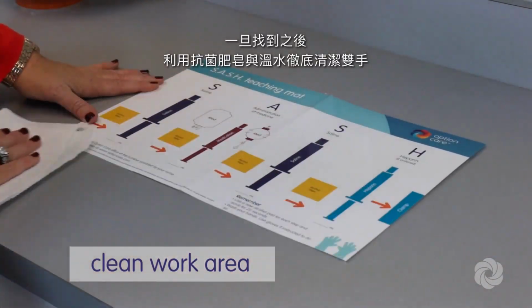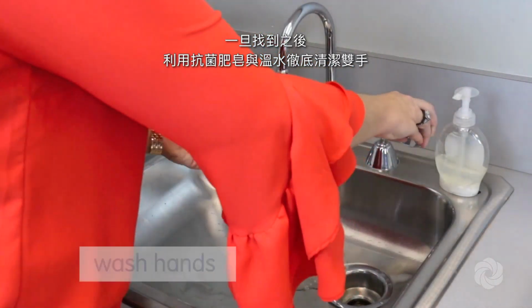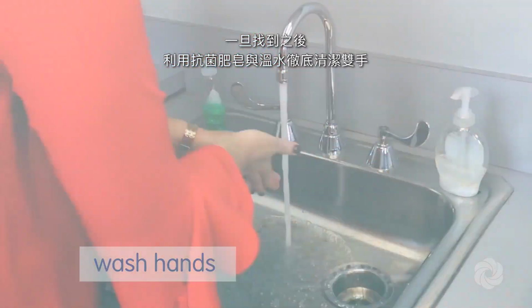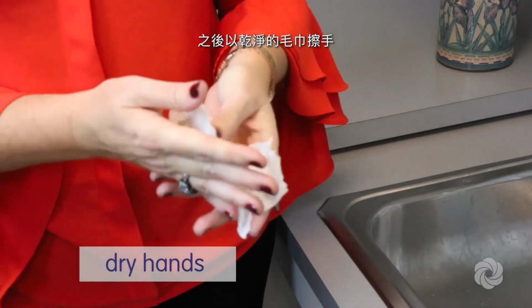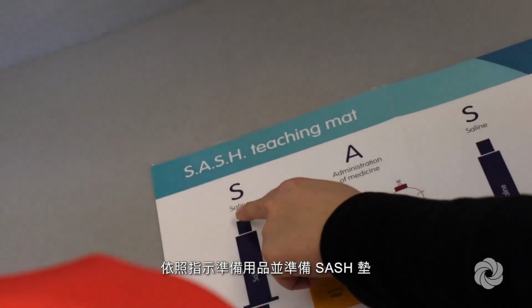Once established, clean your hands thoroughly using antibacterial soap and warm water. If no soap and water is available, use an alcohol-based hand sanitizer. Follow by drying your hands with a clean towel. Gather your supplies and prepare your SASH mat as instructed.